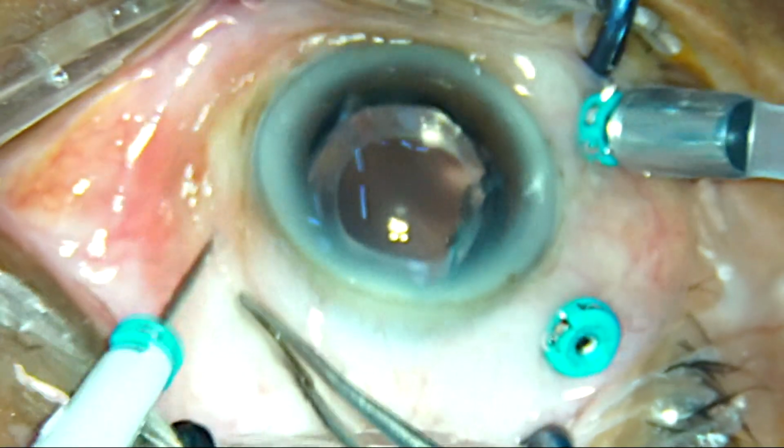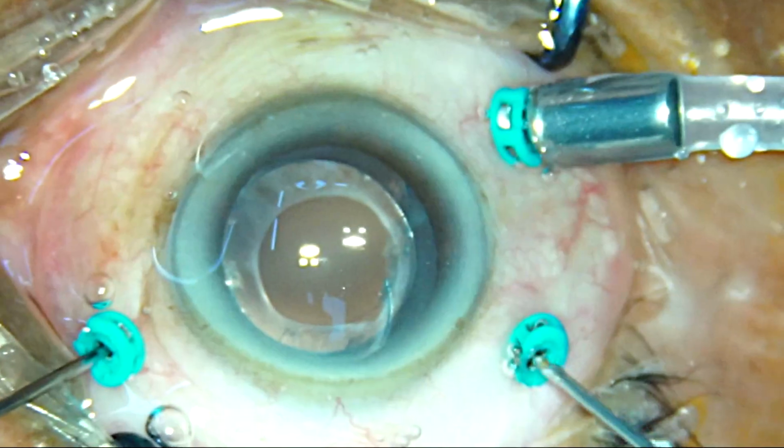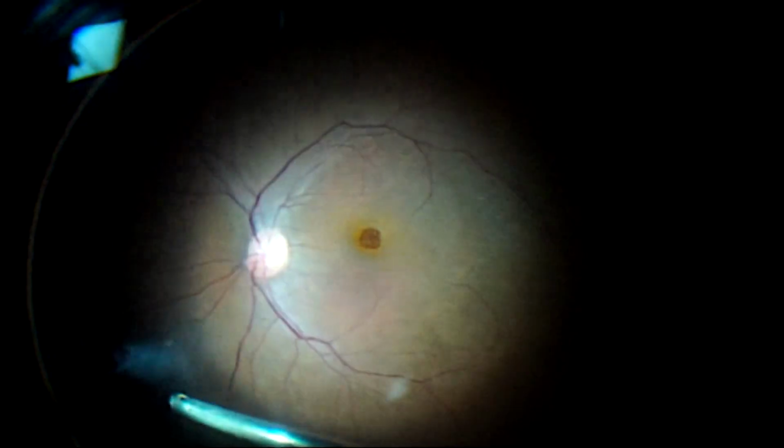Now, coming to the surgery, three 25 gauge ports were made and vitrectomy initiated. After performing vitrectomy anteriorly, the posterior vitreous was stained with triamcinolone to enhance visualization. PVD was then induced with the help of the cutter, and vitrectomy completed, including that of the periphery. A few pigmented lattices noticed earlier in the inferior retina were laser barraged. A thorough 360-degree examination of the periphery by scleral indentation did not reveal the presence of any other treatable lesions.